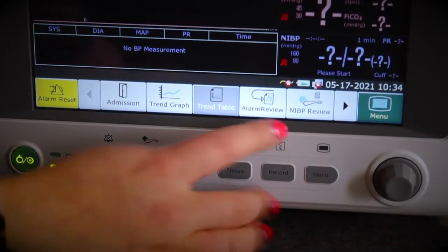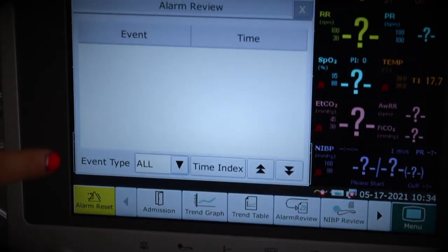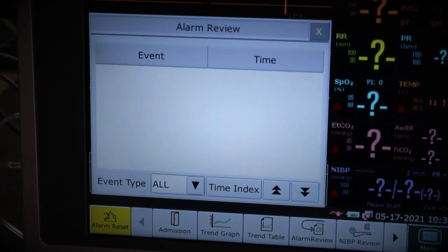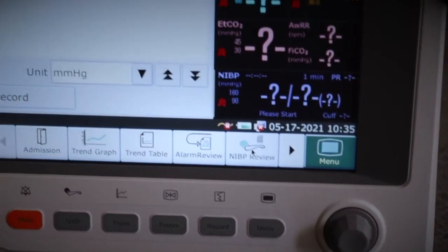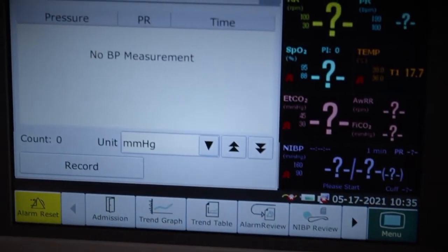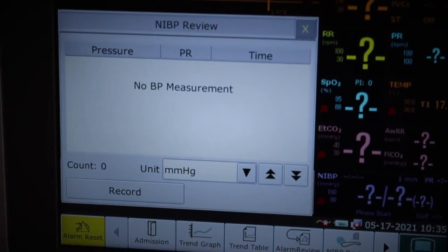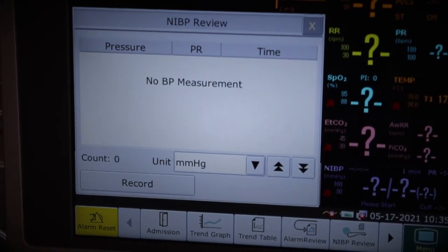Next along is alarm review. Clicking it gives you a list of all the reasons the alarm has gone off, so if you weren't able to see what the problem was, you can go back and see exactly what triggered it. Next along is NIBP review — non-invasive blood pressure review — which gives you a breakdown of all blood pressure readings for your patient. You can hit record to print via the printer.